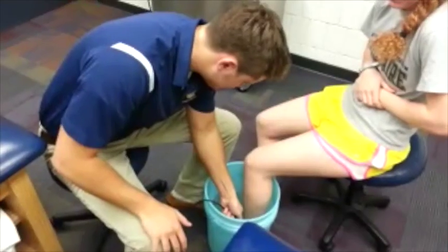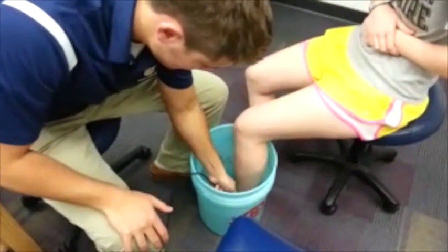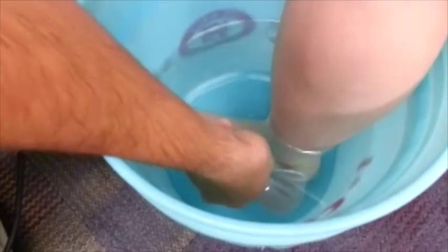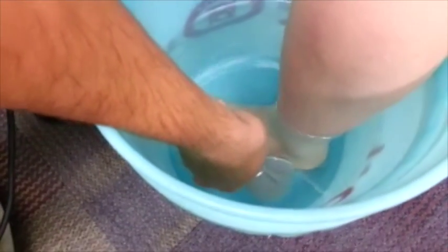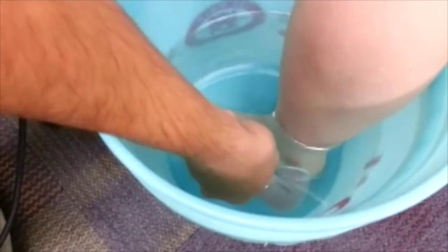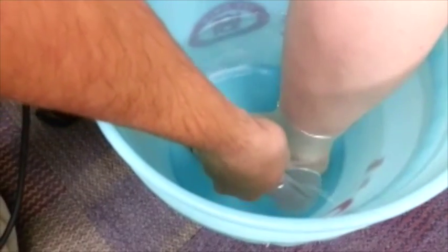After setting up the machine, place the sound head in the water. The sound head should be 0.5 to 1 cm away from the surface area being treated. If air bubbles accumulate on the sound head or treatment area, wipe them away. Move the sound head at a pace of 4 cm per second.